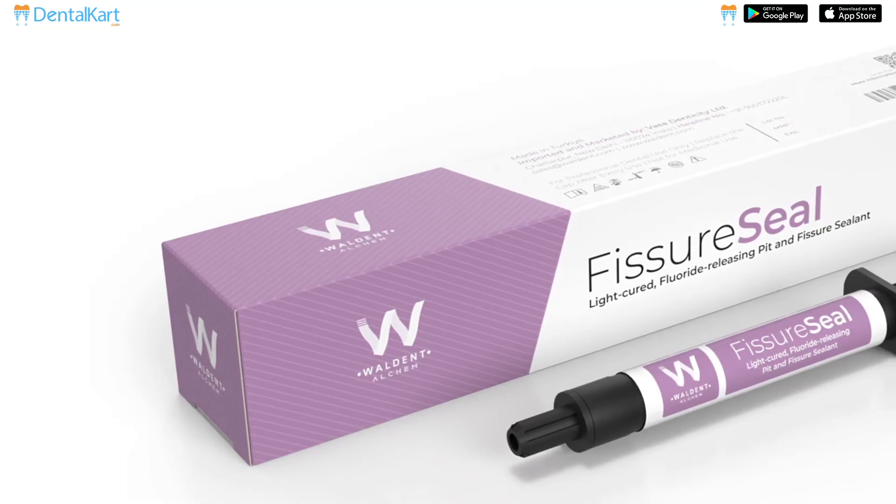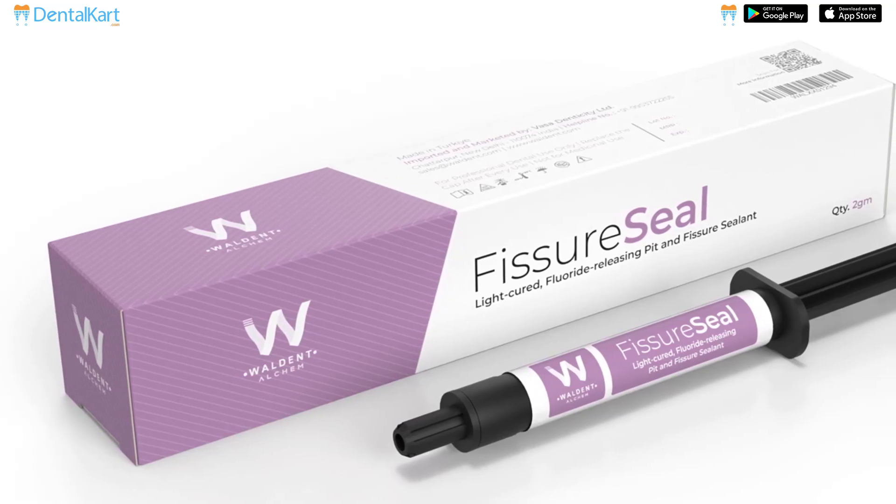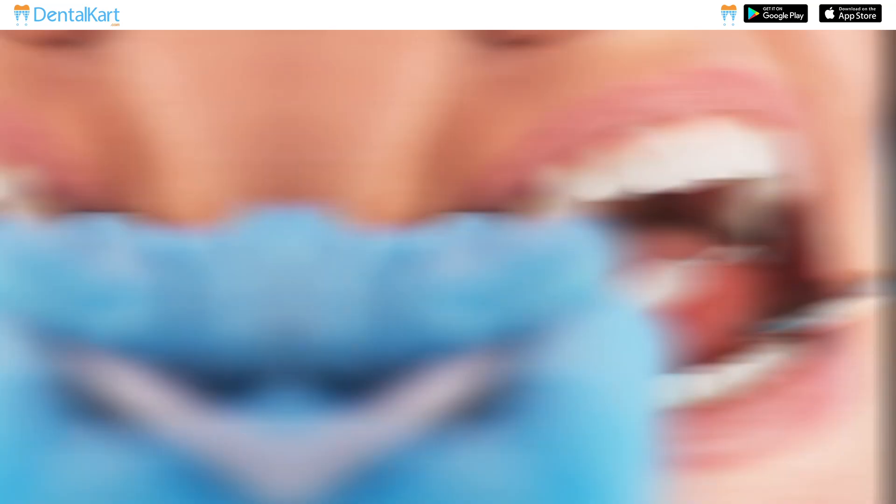Walden Fissure Seal is a light cure, fluoride releasing pit and fissure sealant which is specially designed to prevent dental caries and promote oral health.